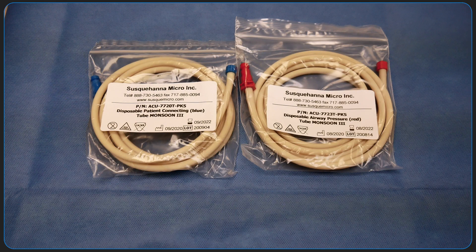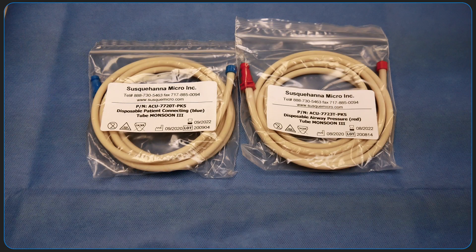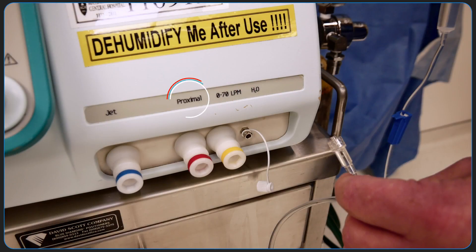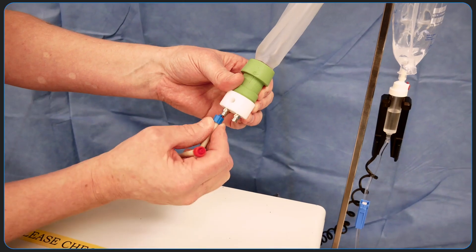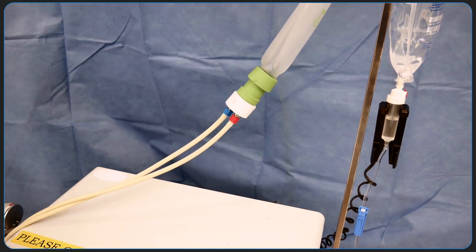Two tubes are demonstrated here. One is the blue patient tube, which is connected to the front of the apparatus labeled JET. The other is the red pressure sensing tube, which is connected to the front of the apparatus labeled proximal. Both are connected to one of the two lower lock connections on the test lung prior to jet ventilation.